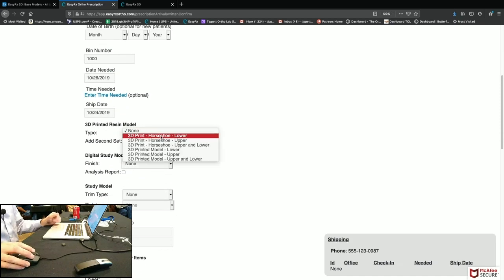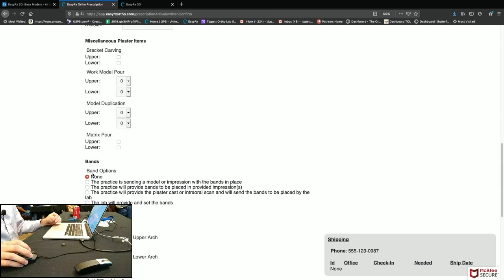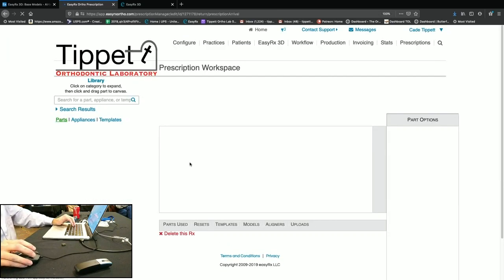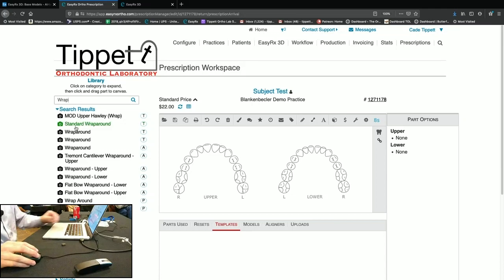So let's say this is horseshoe upper and lower, and then we don't need all that stuff. And then you check in and edit. What appliance you want to make? Let's see. Let's start with the. So there's a wraparound.